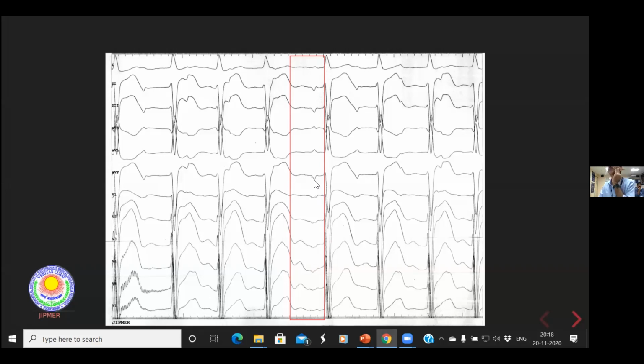Once you can see a P wave, we can look at the morphology. So first, when we look at the morphology here, and you can see the next P wave is here, you can see there's a long isoelectric interval and fairly narrow-appearing P waves. Now, the way we are taught in ECG, with an arrhythmia like this with fairly long isoelectric intervals, we would think this is a focal atrial tachycardia, with a rate of close to 100. However, we know that in conditions with extensive scarring, the presence of an isoelectric interval and a slow rate can be misleading, and despite that, this can be macro re-entry.